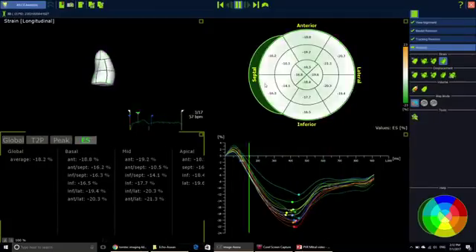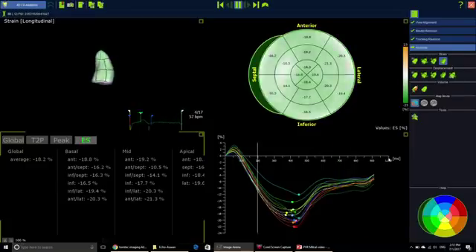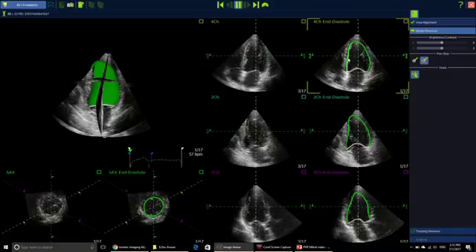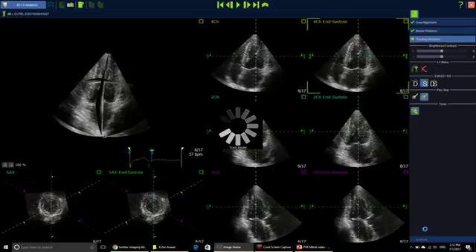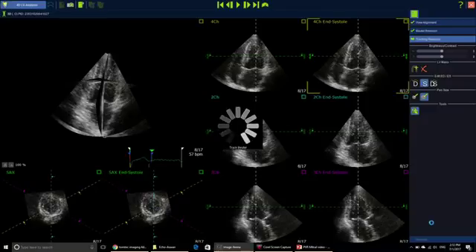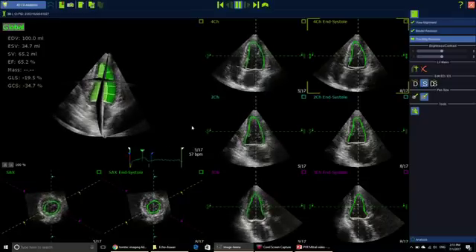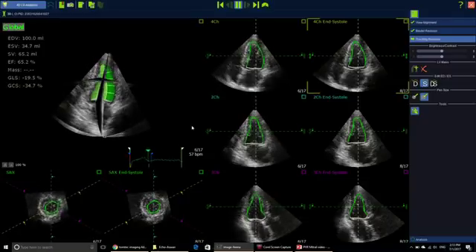This is how you can do it. If you need to edit again, you can go for 'Tracking Revision' and edit again at any point, and the results will be recalculated. This is a very good thing about this tool — it is very easy to use and you don't need to start from the very beginning each time you need to edit anything.